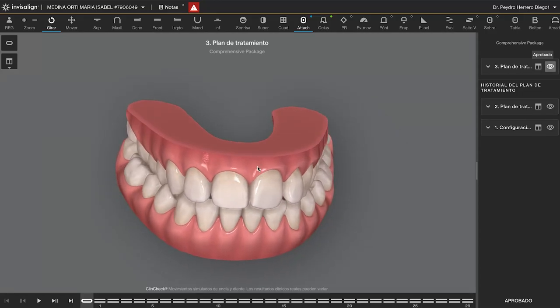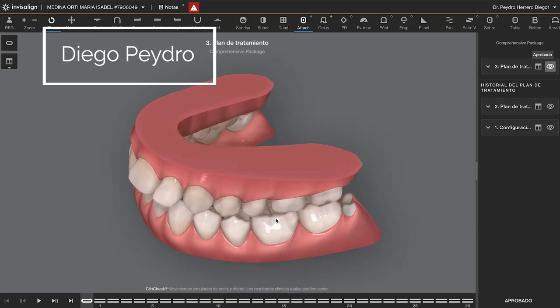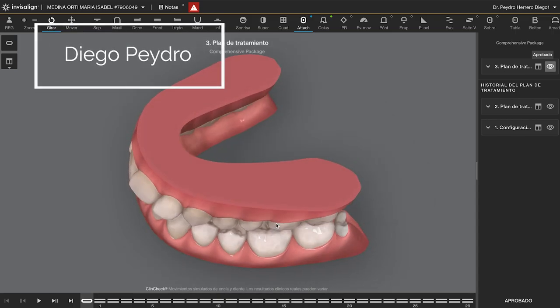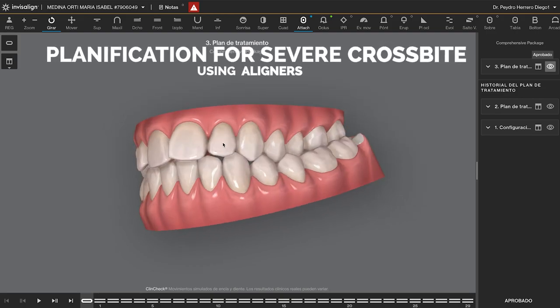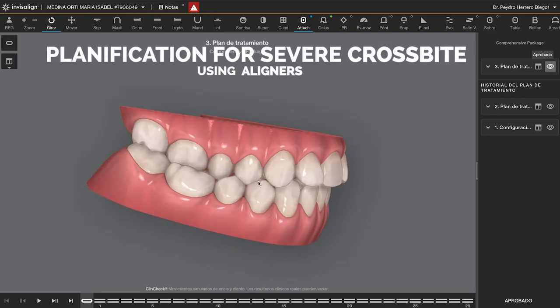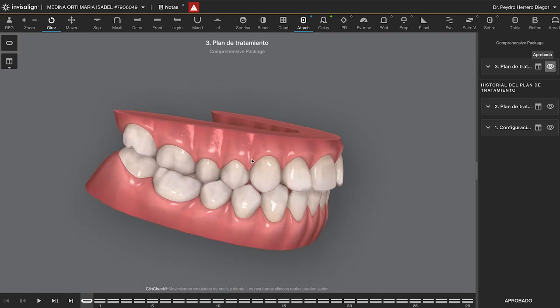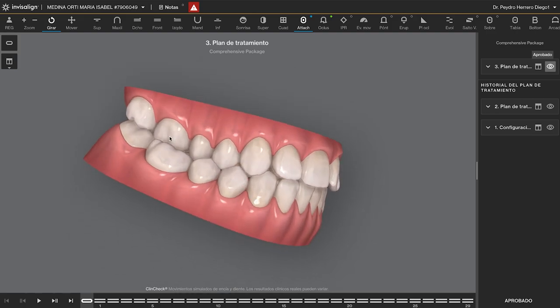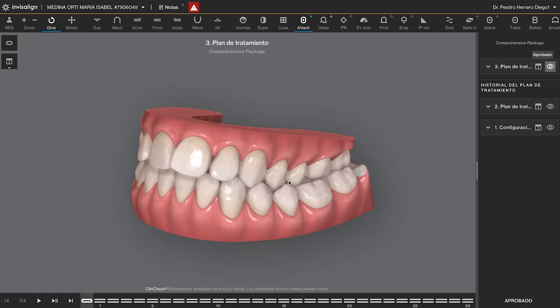You can see the full crossbite on the left side, and also the crossbite on the right. On the right, I only have crossbite with the six, so the seven is going to help me to solve the crossbite on the right side.